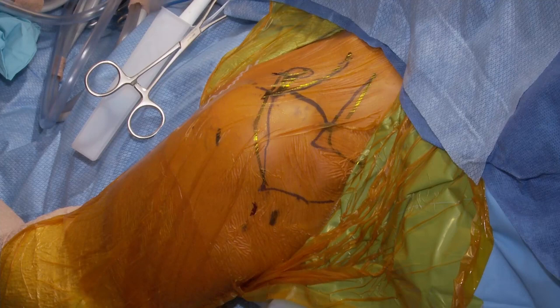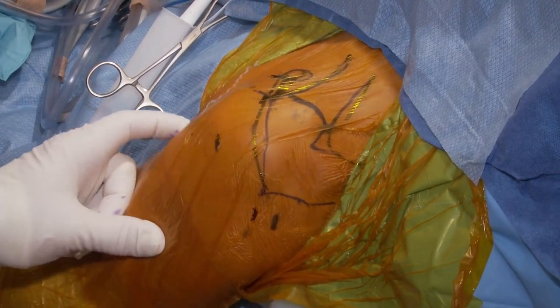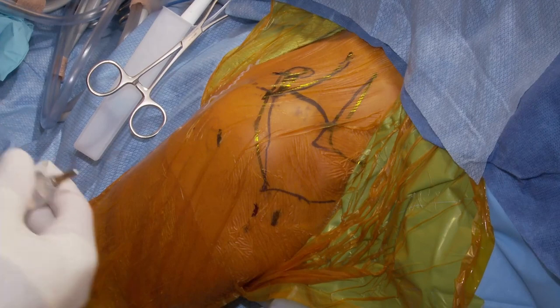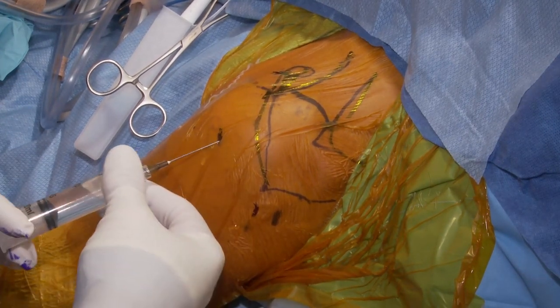At the end of the procedure, we're going to perform an open biceps tenodesis through a subpectoral approach, and we'll describe that as we get to that part of the operation. Local anesthetic is helpful in the posterior aspect of the shoulder in particular, but it can also help with some hemostasis in the subacromial space.